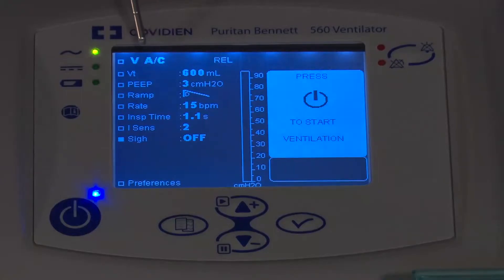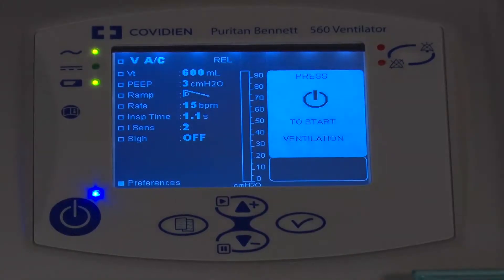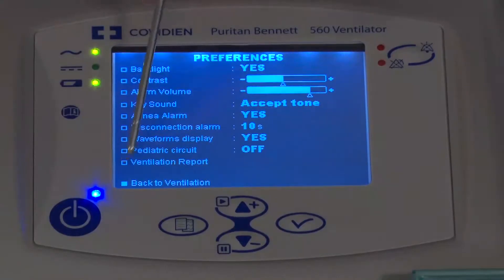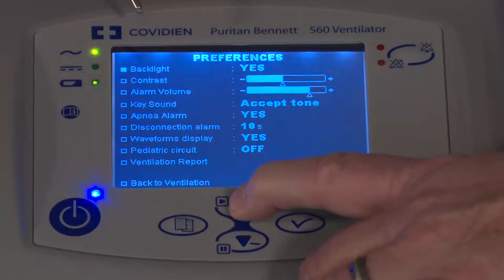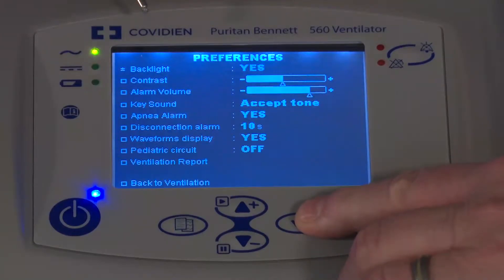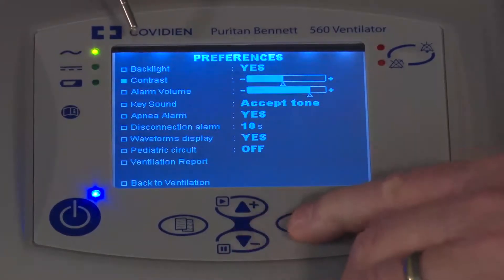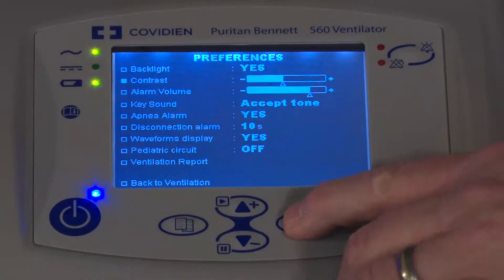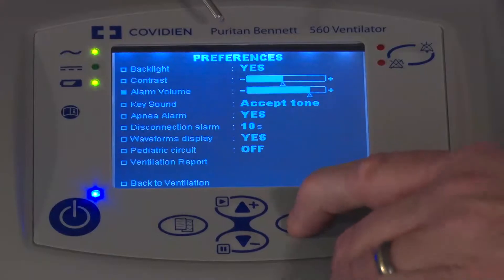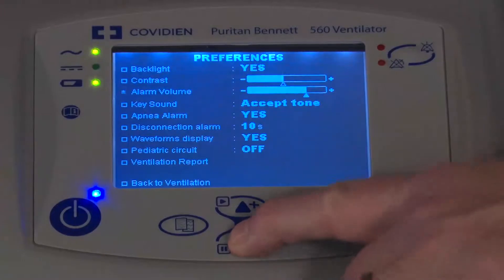Once I'm done with the primary screen for the mode that I'm in, at the very bottom there's a preferences button. I'm going to move down to preferences and press accept. Here are all the preferences for a particular mode of ventilation. At the top is the backlit button — I do want it backlit. Then there's contrast, where I can change how bright the screen is. For alarm volume, I press the check mark button to get in and adjust how loud the volume is.